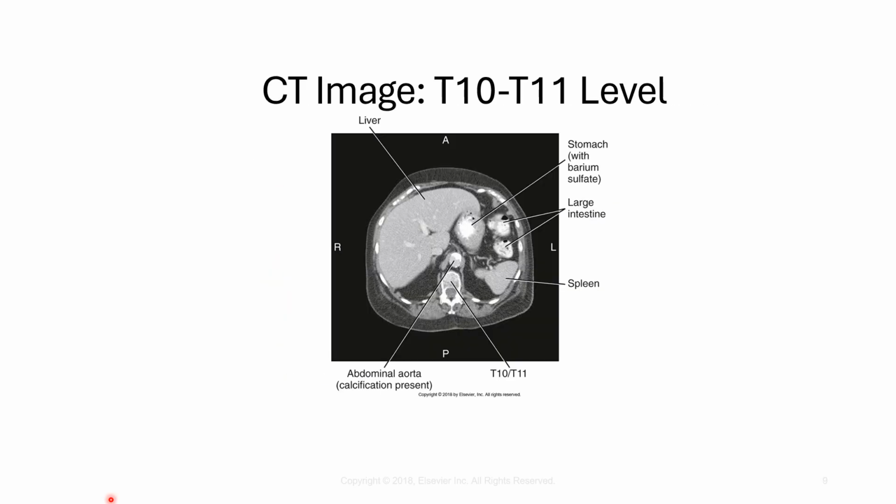These are CT images, which we've talked about in class, the fact that CT images are important to start looking at cross-sectional anatomy. So as mentioned in class, this would be a transverse cut. So imagine you were standing at the foot of the table at the patient's feet, and you bent down and you were looking up from their feet towards their head. And this would be an image if the patient was a loaf of bread. Each slice in the loaf of bread would be represented by one of these CT scans.